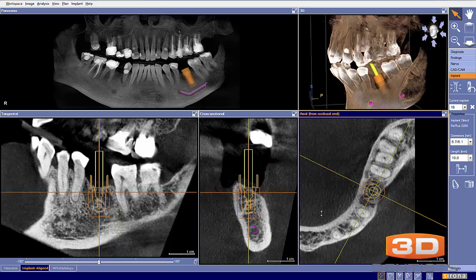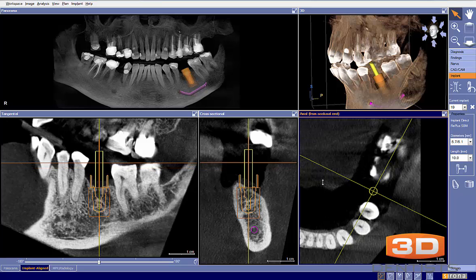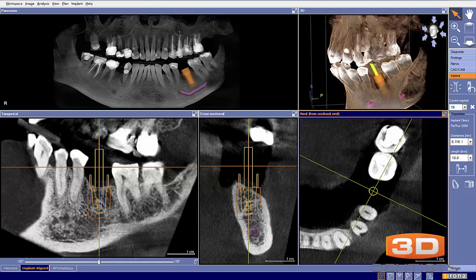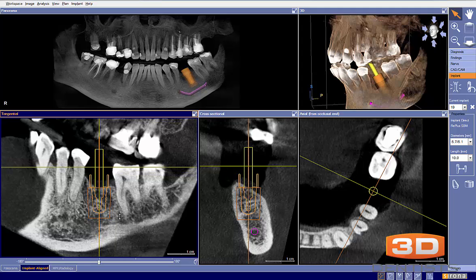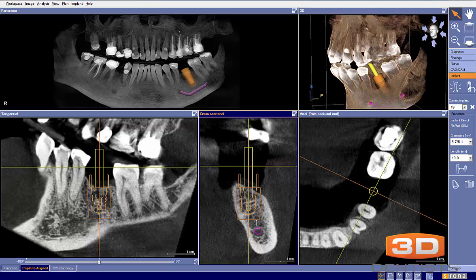After bone level, let's look at the occlusal table. I'll drag a line so we can see the tops of the teeth. I can outline the buccal aspect, the lingual aspect, the distal, and the mesial. From this I can identify the center — and we're pretty close, but not quite perfectly centered. So I'll go ahead and center this about like so. Now we're centered, and buccalingually we can go a little bit more buccal, which is a bit more centered there as well.